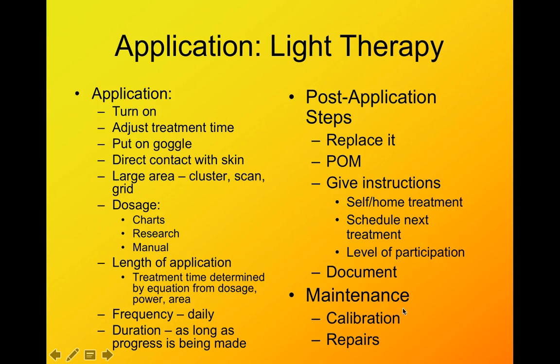And then maintenance: we need it calibrated. Want to make sure that we get any repairs, look for the cords, making sure that they're all in good working order. Check the lens for any dirt or grime buildup and clean that with an approved cleaner if necessary.